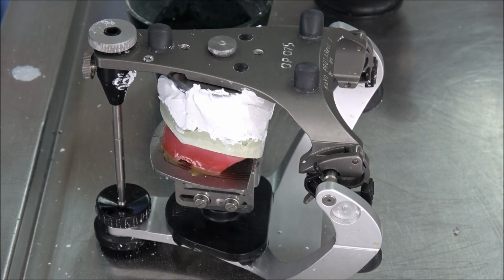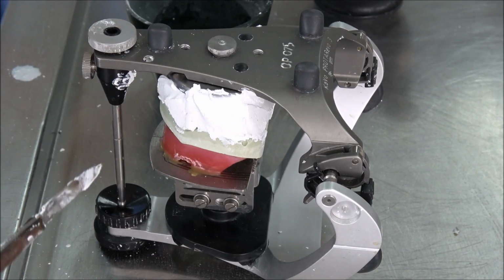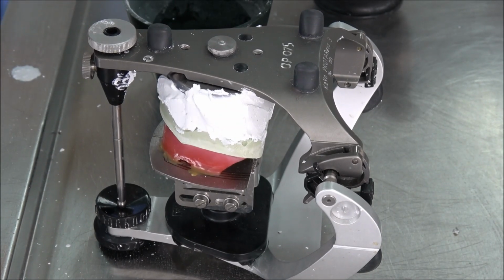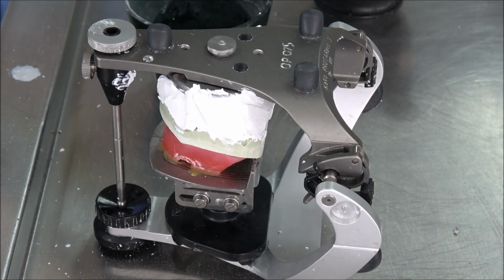Actually, you don't need to remove it properly following the line. You can leave some excess part. Later on, you can trim it. You can use your sandpaper to smoothen it. We just roughly remove it and make sure don't move your articulator.